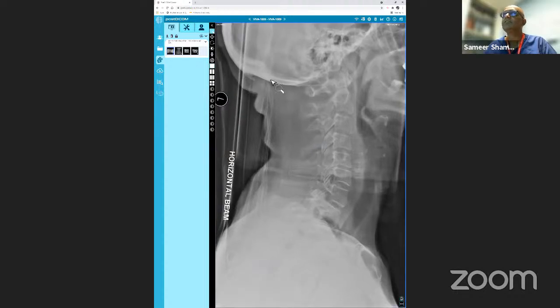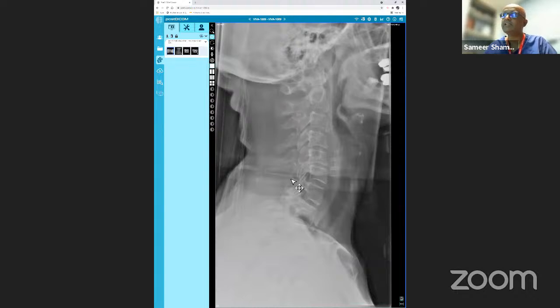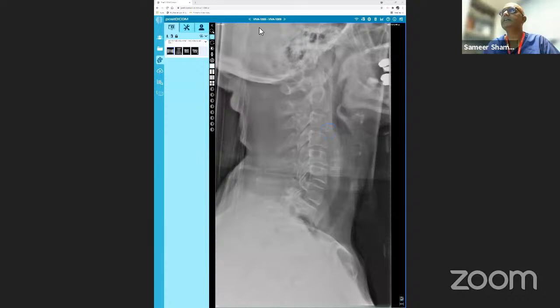So you can see in your normal practice, you said you would do anterior spinal line, posterior spinal line, and spinolaminar line. Here, can you see this bone fragment? Yeah. So that bone fragment is a classical teardrop sign, flexion teardrop fracture. Okay. So this is a very important, significant injury, because whenever you have flexion teardrop fractures, you get invariably facet joint dislocation. So you need to look for perched facet.